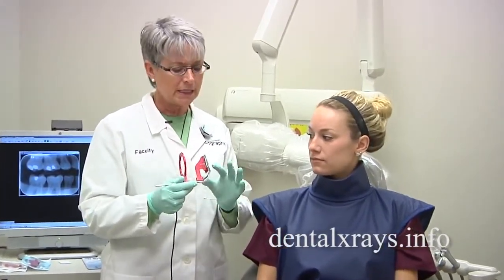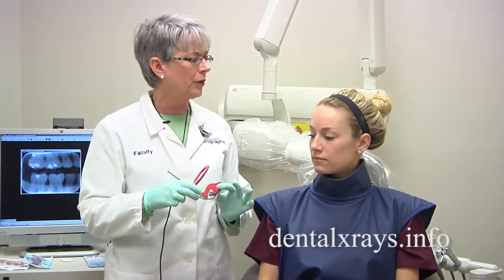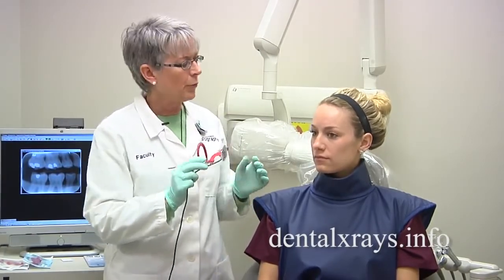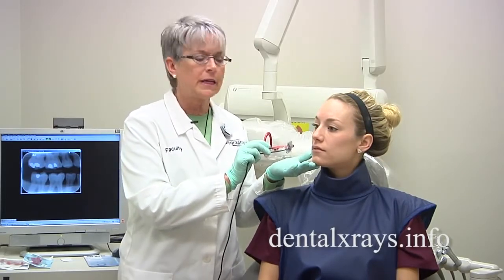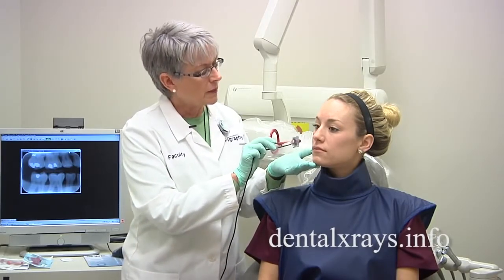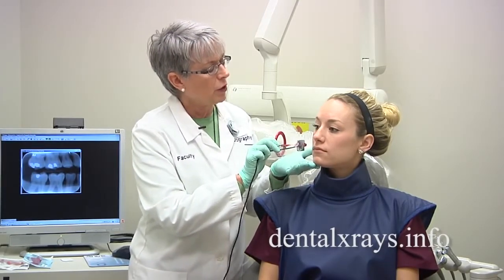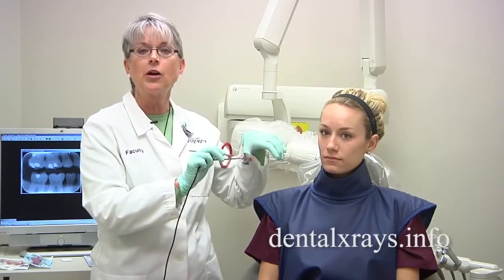Sometimes it's just hard to get that distal of the canine because the sensors are a little thicker and a little harder. What happens is that when you try to put the sensor close to the patient's tooth, you're not going to be able to get a good view — it's not going to be close enough. You're going to have to move it toward the middle of the patient's mouth where the arch is higher.